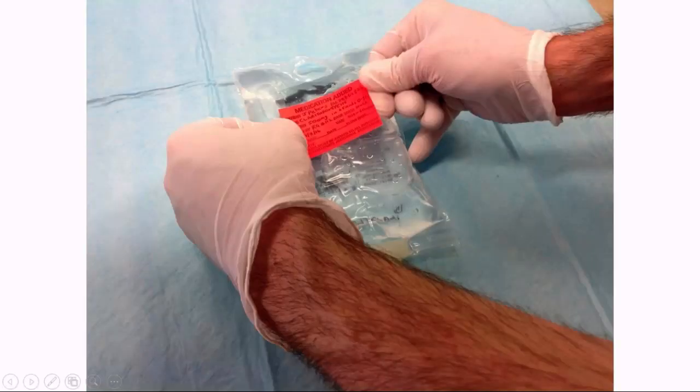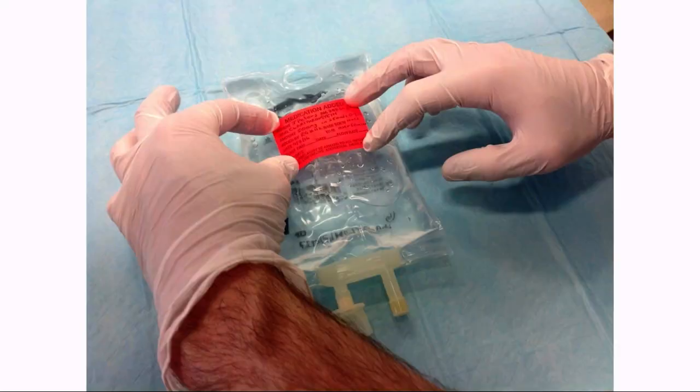with clarithromycin. This label here with the patient's name, the drug name, clarithromycin, the patient's medical record number, the amount that we've added into the bag, 500 milligrams, and the solution that has been added into 250 mils of 0.9% sodium chloride. We sign it and we put the date and we put the duration of the infusion as well. Then we put that sticker onto the bag.